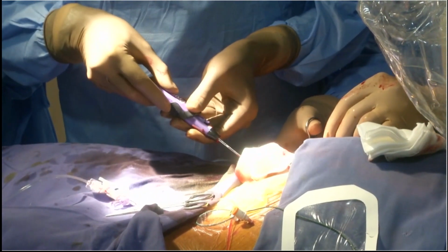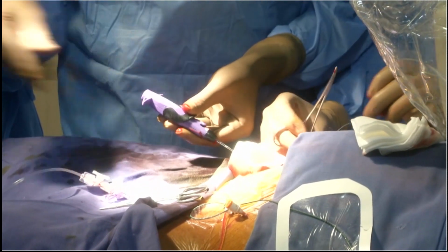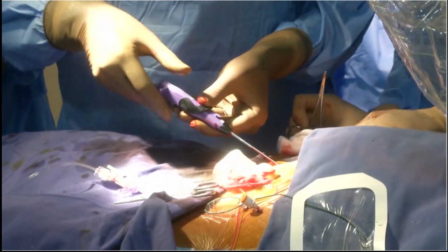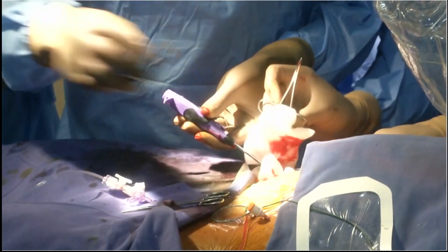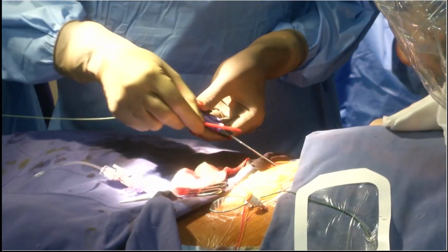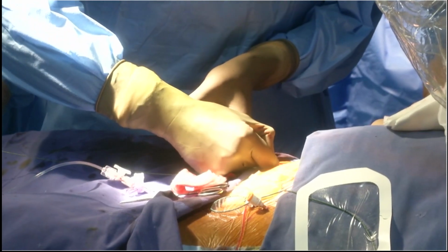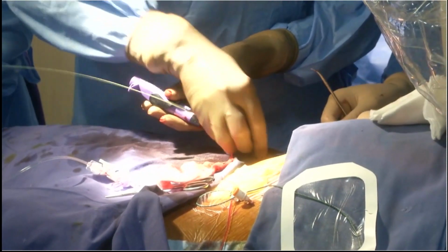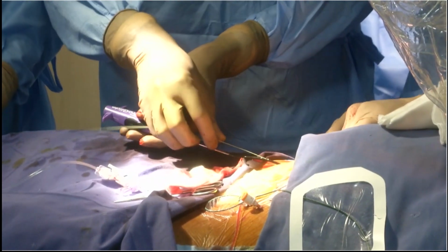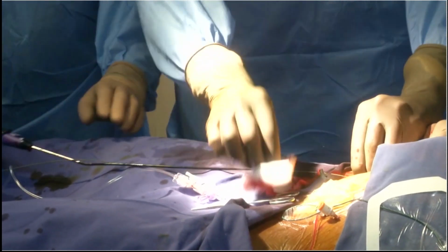As you can see here, the ProGlide is being inserted, and usually we use 2 ProGlides. The only discussion here is the location of putting these ProGlides, because earlier, when the angle we used was more than maybe 90 degrees, or up to 90 degrees, the chance of cinching the vessel is higher. But if the angle is too small, then the chance of needing a third device also comes in. So how do you manage that?